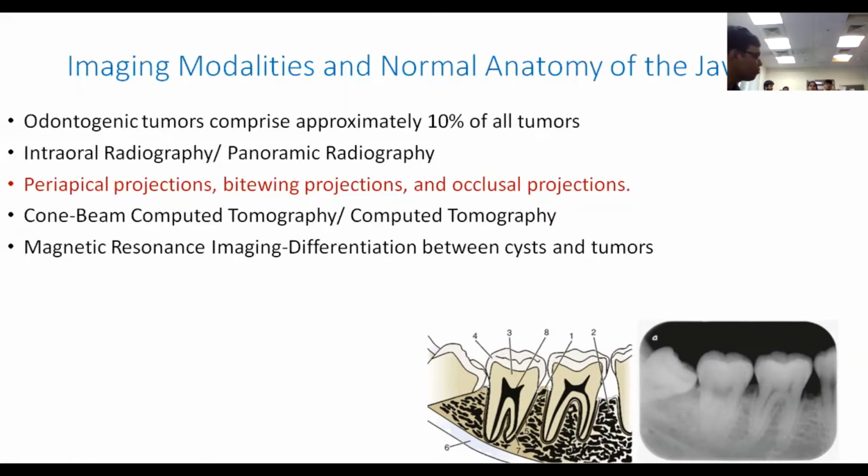Intraoral radiography has very high resolution as compared to both CT and MR. If there is any bone tumor, it has to be integrated with the intraoral radiography view. You should not report these tumors without intraoral films. If there is none, then we have to ask for an OPG, because we don't have intraoral radiography in practice. We can ask for radiology whenever a jaw tumor comes up. Sometimes we will just ask for an OPG.